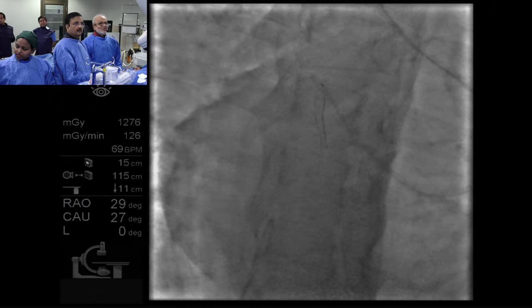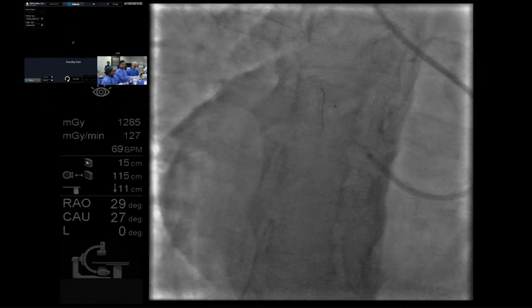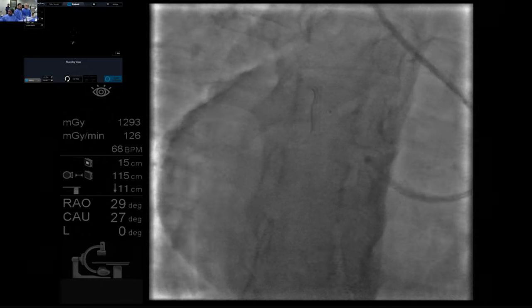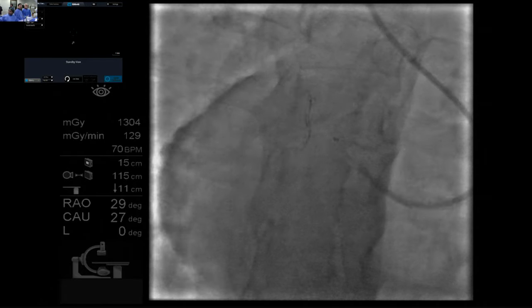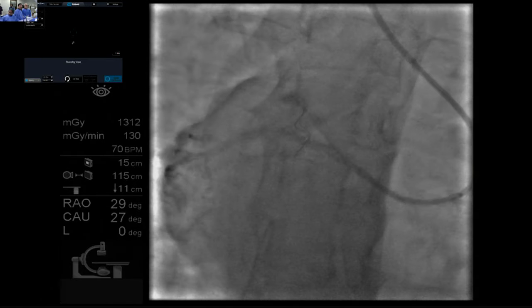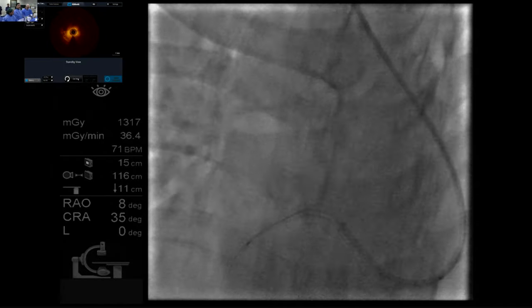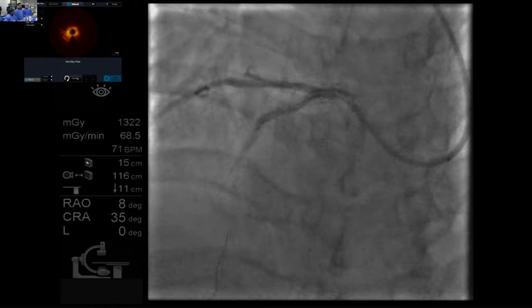Rajiv and Tak, what do you think? The question is, after the stenting, is there any benefit from a cutting balloon? Probably no. Go to AP cranial and check it. The scalpels will not be able to meet the tissue, right? Just check it out. Okay, fine.